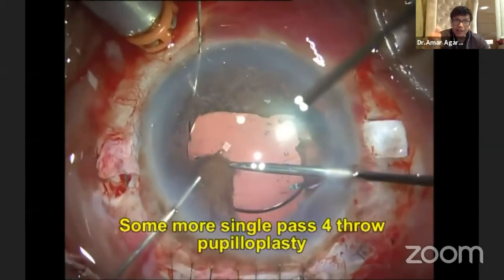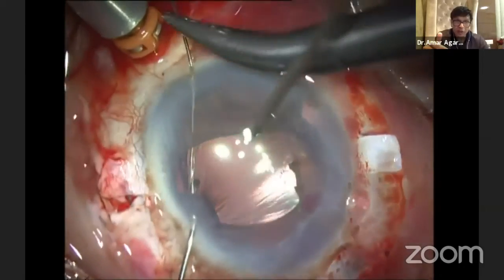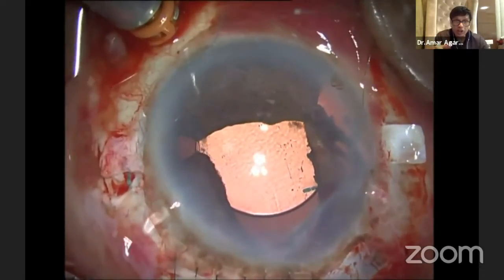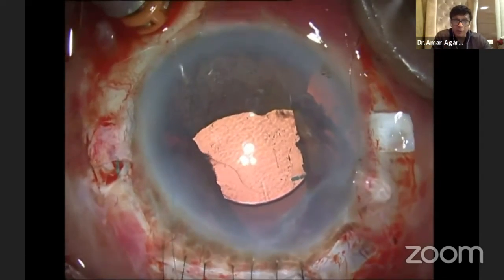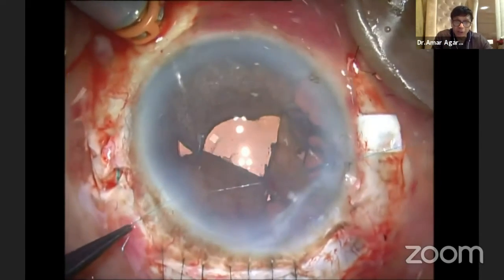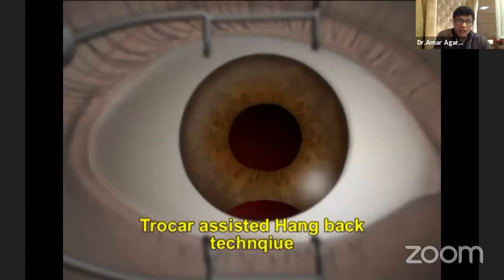I've done one. Now I'm going to do a second because I need to make it smaller. My second single-pass, four-throw pupilloplasty is done. But the superior is still problematic, so now I'm going to make my third one there. Now what we have is we have created an iridodialysis ourselves.